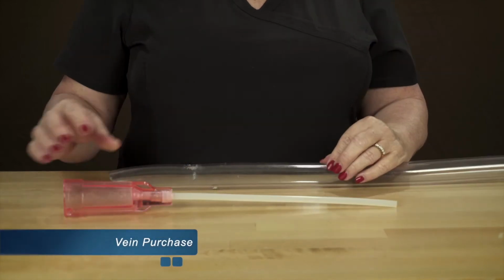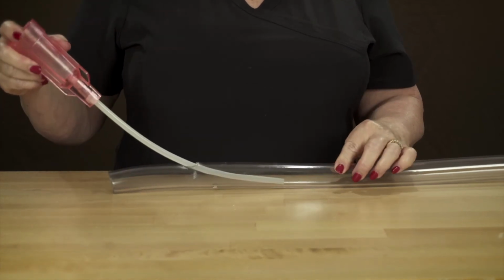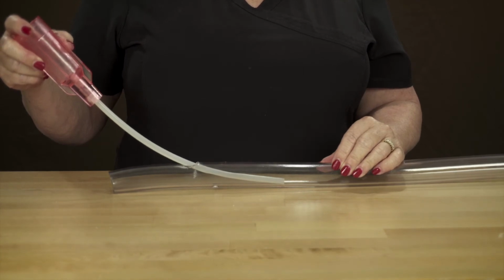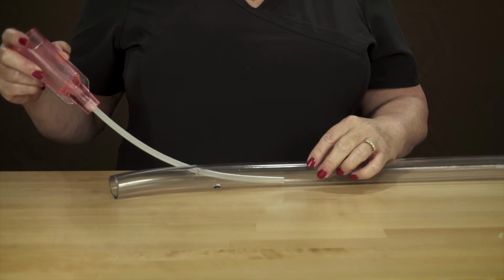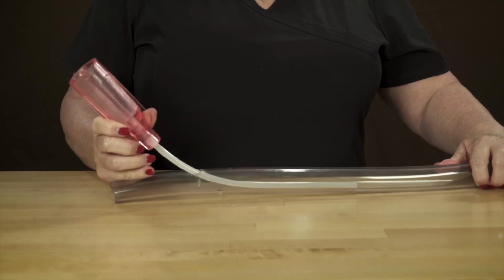Vein purchase. Insert about one third of a cannula into the vein. Explain how the tip of the cannula may abut the vein wall, causing irritation or even damage to the intimal wall, and could possibly create a wall shear stress, where the flow of the infusate is aimed directly onto the vein intima.